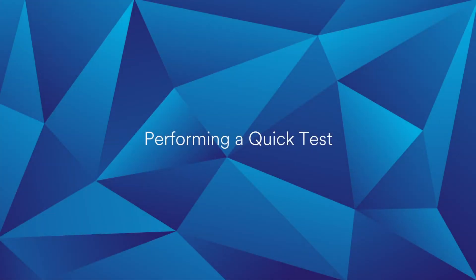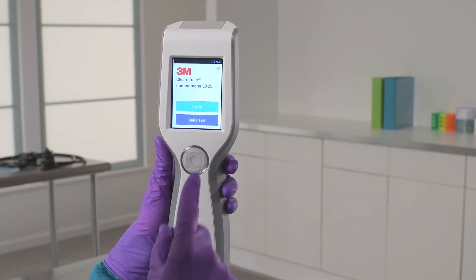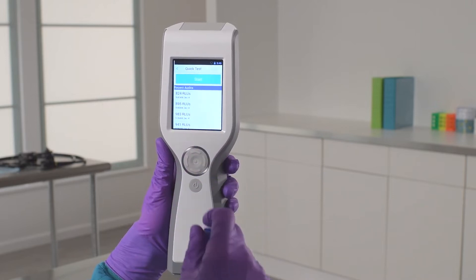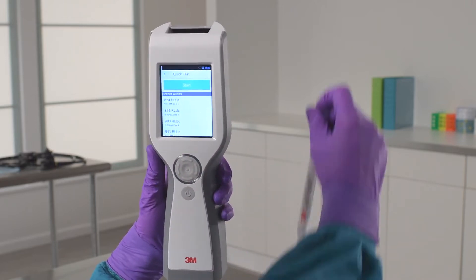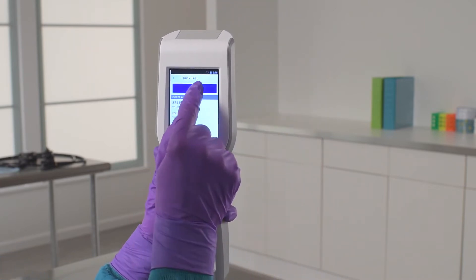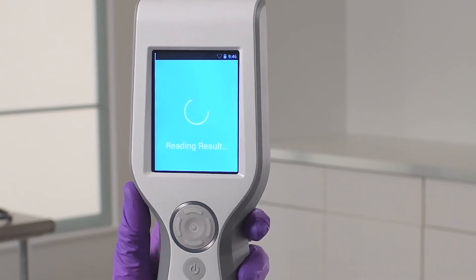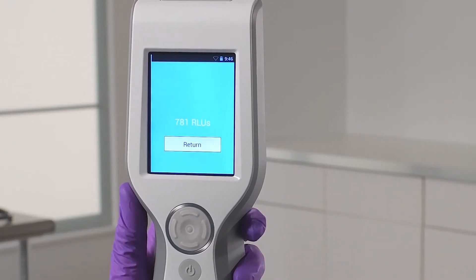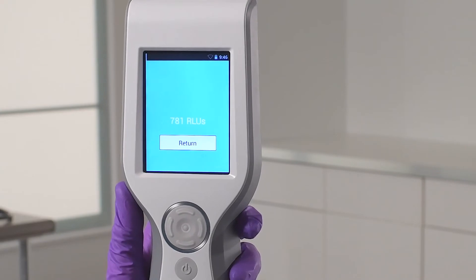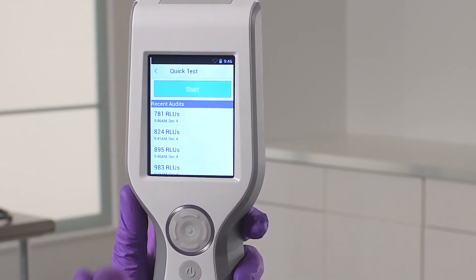We'll start with a quick test, which gives you immediate results. To start the test, you'll see a screen with options for Login or Quick Test. Tap the Quick Test button. Place your ATP test into the sample chamber, close the chamber lid, and press the Start button. In 10 seconds or less, you'll see the result — a quantitative RLU value. Results from a quick test will not be uploaded to the 3M Quality Control Data Manager, but it is a good option for a quick reading.